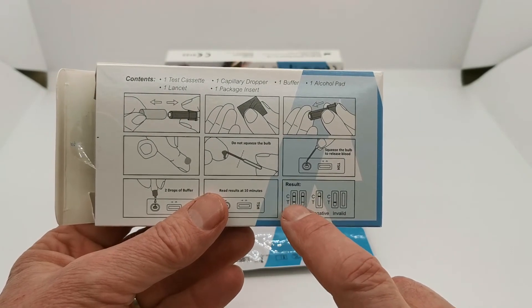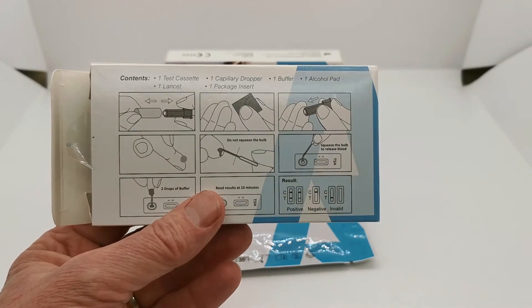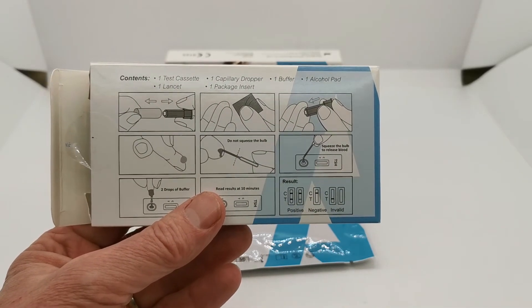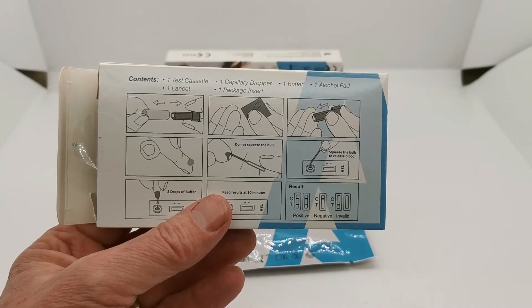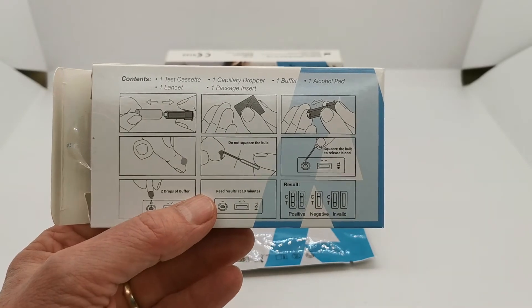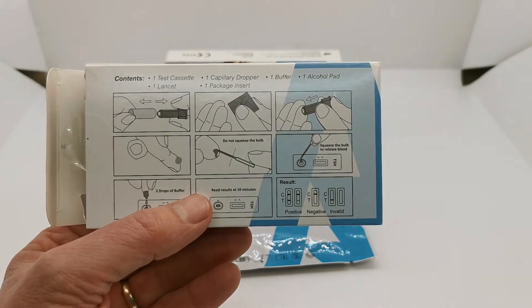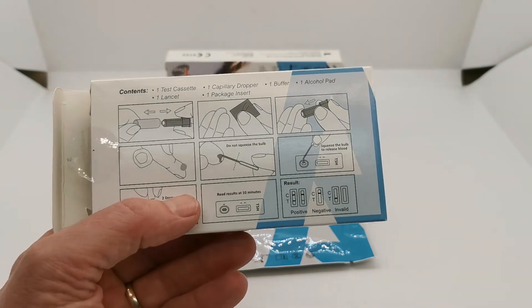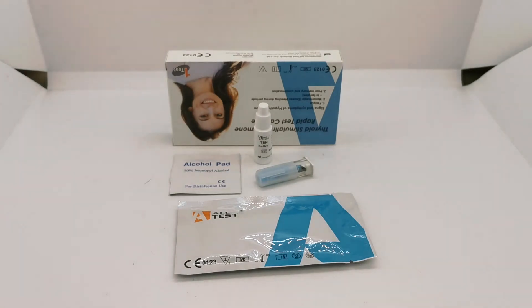The result panel uses a standardised format. A positive result is a test line in the presence of a control line. The test line colour density, saturation and thickness may vary from test to test, but as long as a test line is showing at the read time of 10 minutes it's a positive test. A negative result is indicated by a control line with a complete absence of a test line. If you don't get a control line, that is considered an invalid test — it means the membrane has not run fully and insufficient sample or buffer has been added.